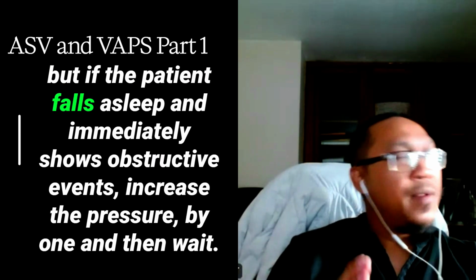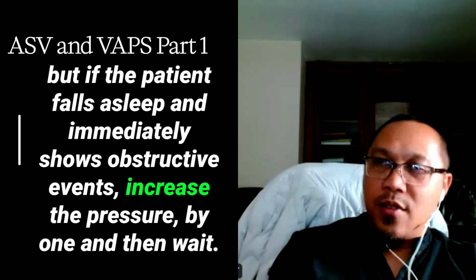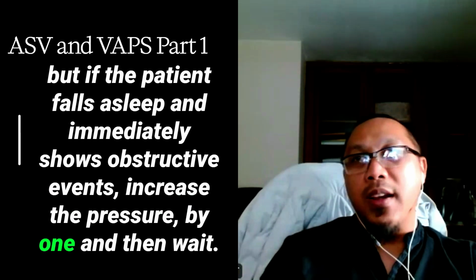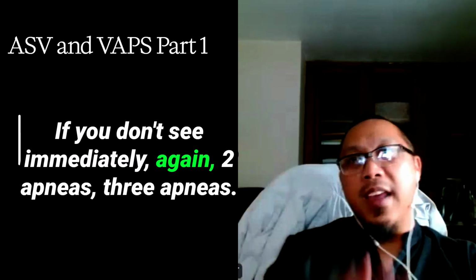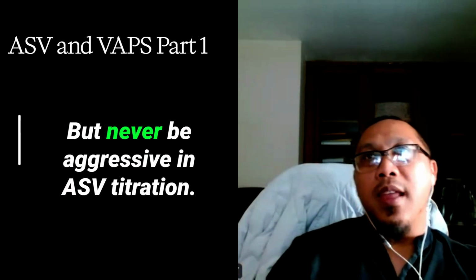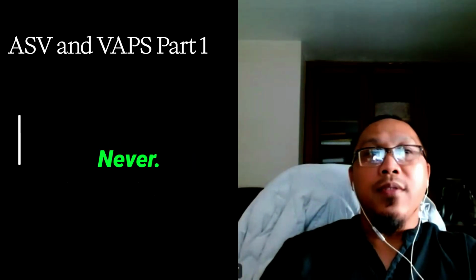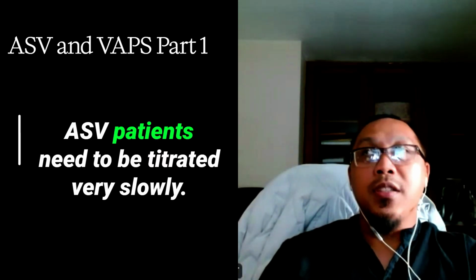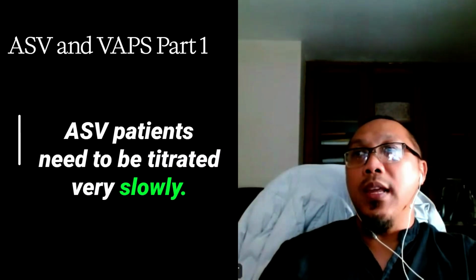But if the patient falls asleep and immediately shows obstructive events, increase the pressure by 1. And then wait 5, 10, 15, 20, 30 minutes. If you don't see immediately again 2 apneas, 3 apneas, then increase pressure. But never be aggressive in ASV titration. Never. ASV patients need to be titrated very slowly.